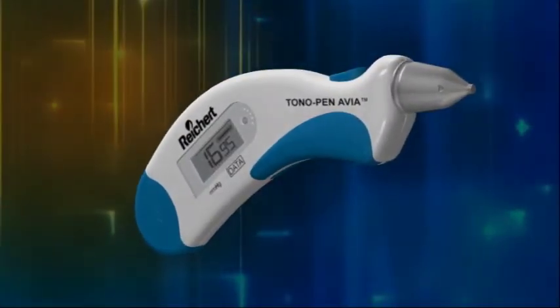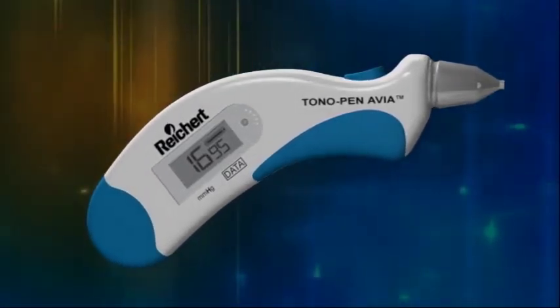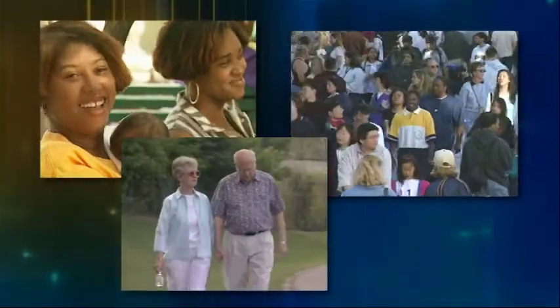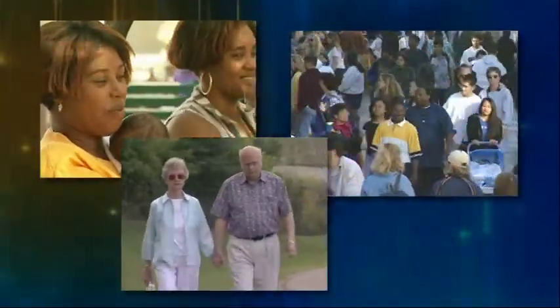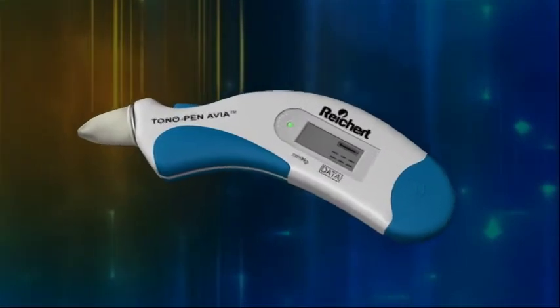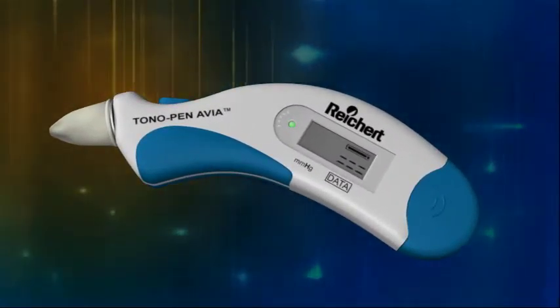The Rikert Tonopena Via Handheld Tonometer is the next generation in the Tonopena family of applanation tonometers. A wide range of patients are considered to be at risk for glaucoma and may need routine screening. The Rikert Tonopena Via Tonometer offers the medical community a simple and accurate option for patient screening.